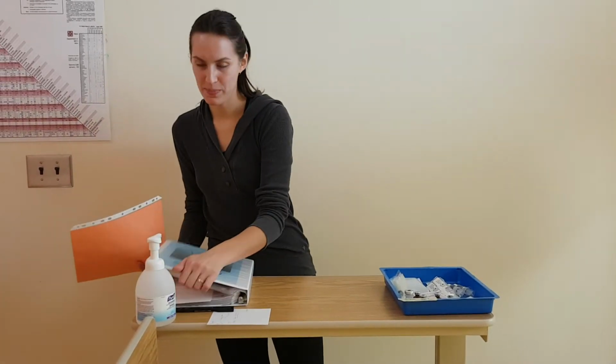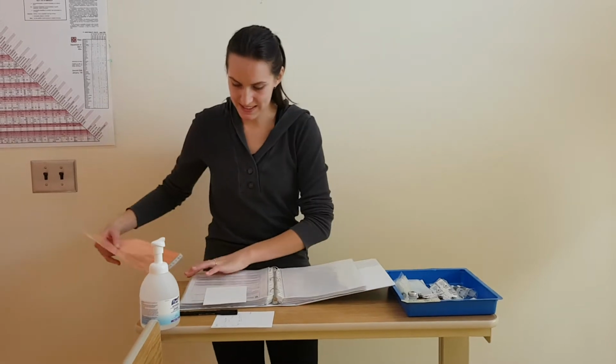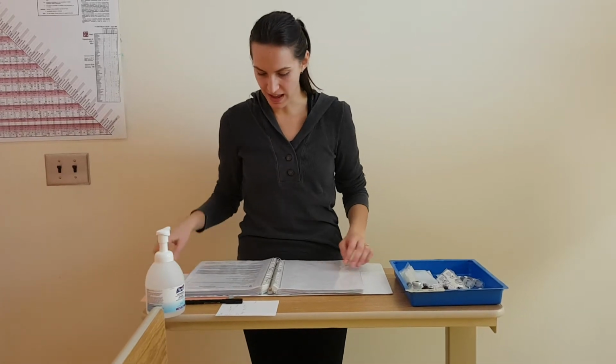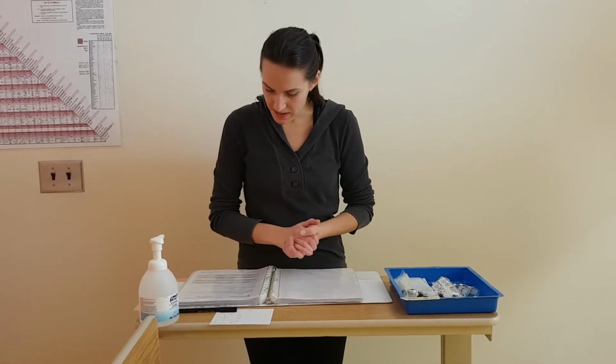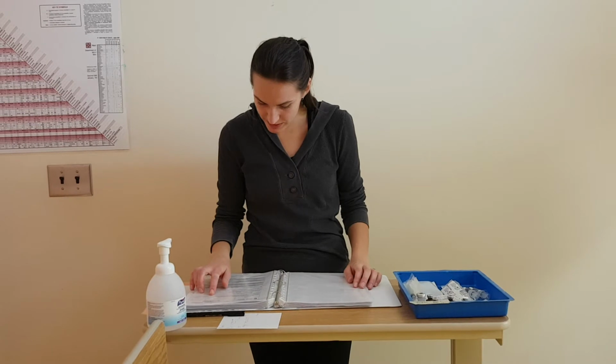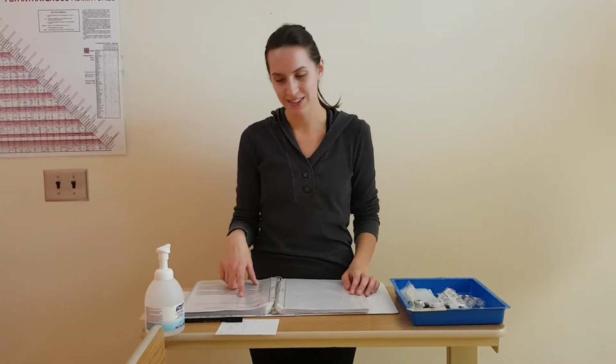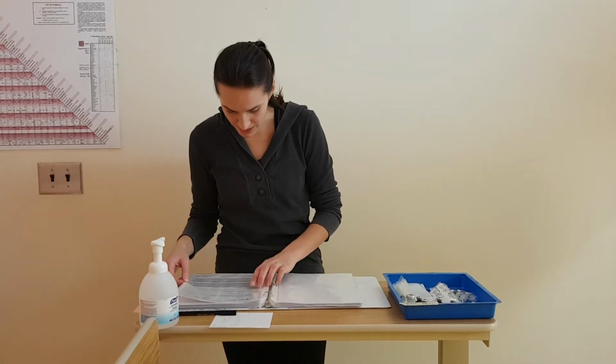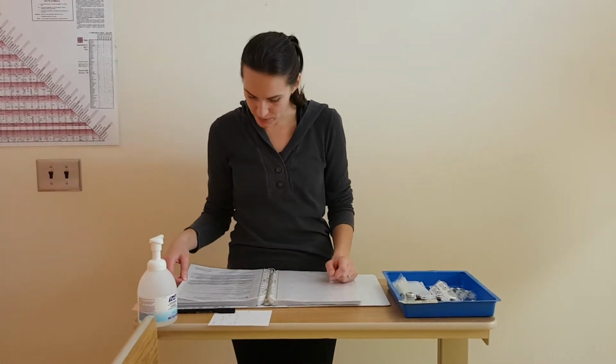I'm going to look at my parenteral drug monograph here. I see it is a diuretic, the class of diuretic or antihypertensive. This is appropriate for my patient because they have high blood pressure. It can be given by a nurse or a student nurse, and the dose that the doctor prescribed is within the safe range. As noted on the parenteral drug monograph, it's supplied as 10 milligrams per milliliter.